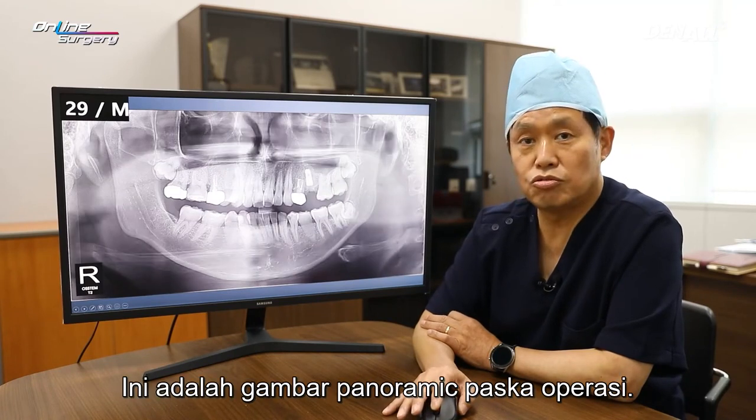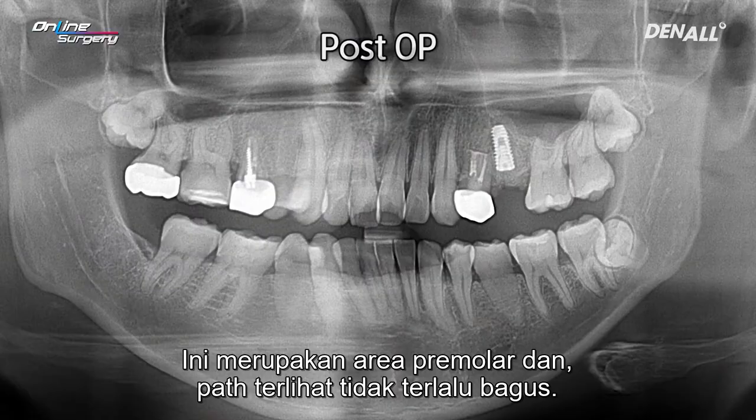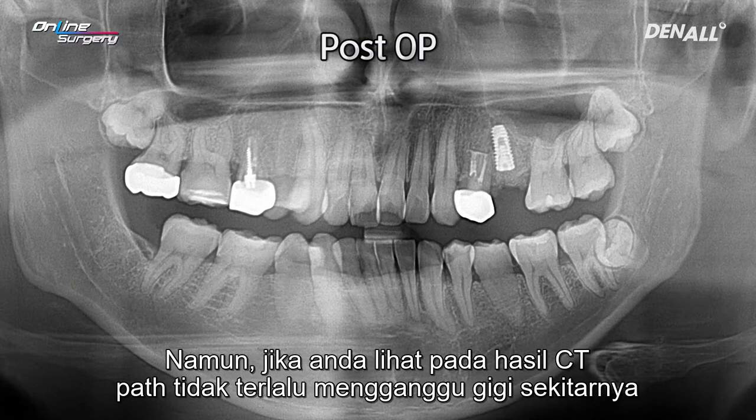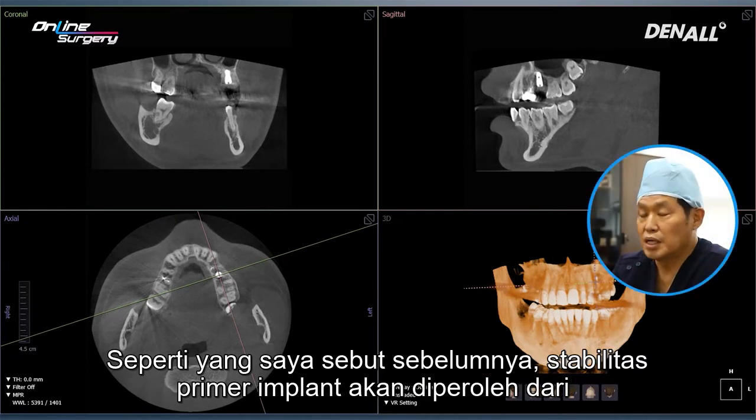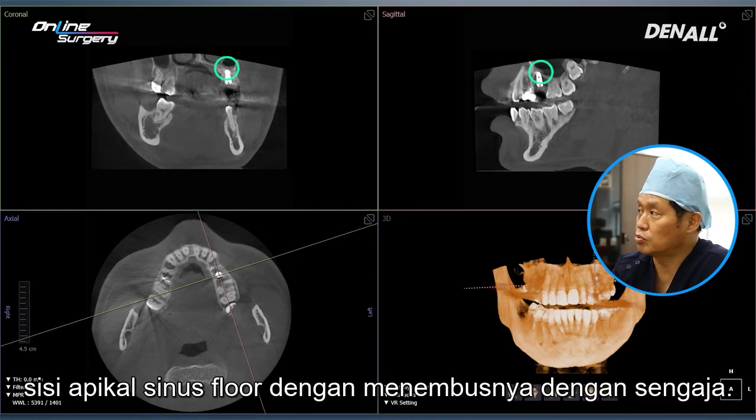This is post-op panoramic image. This is a premolar area, and it looks like the path is not very good. However, if you look at the CT with the adjacent tooth, the path is not very problematic. As I mentioned earlier, primary stability of the implant is going to be gained from the apical side of the sinus floor by penetrating it intentionally.